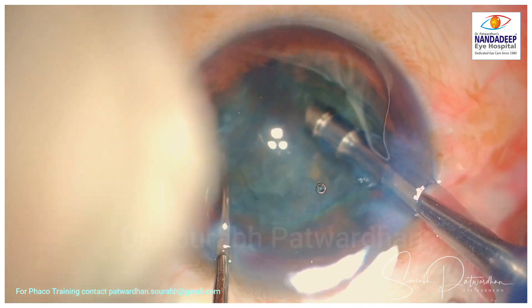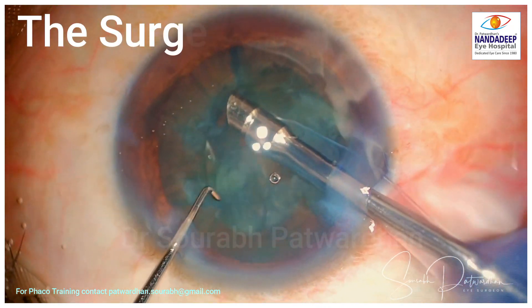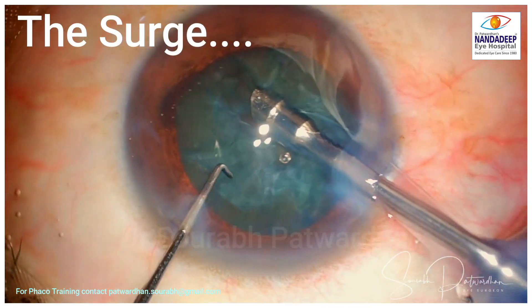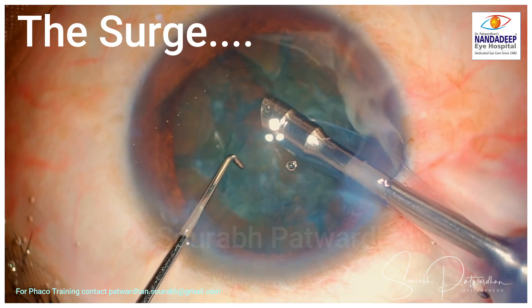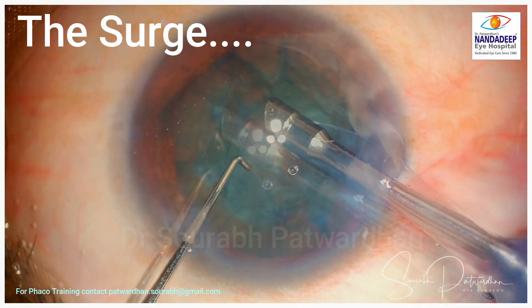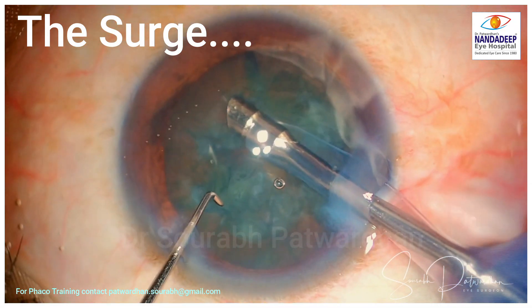Now I can see that there is one piece which is separate, so I am going to use high vacuum — and that's when I notice the surge. Watch it again: the AC collapses as the occlusion breaks.